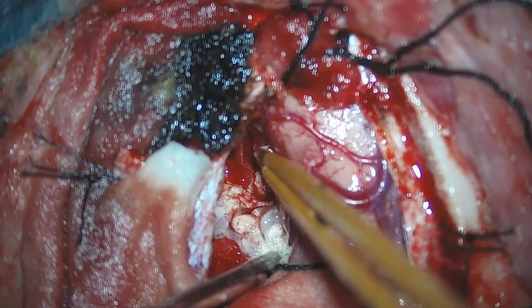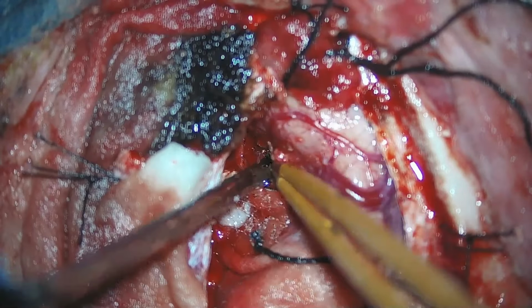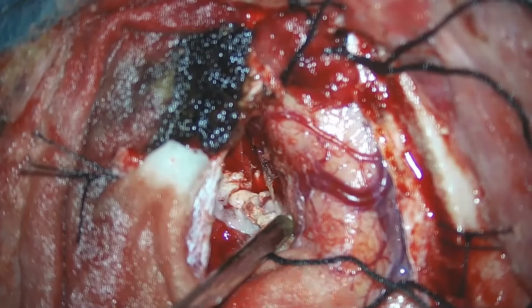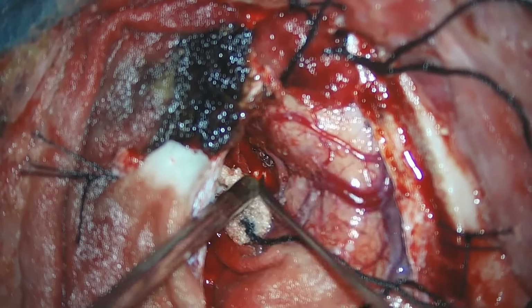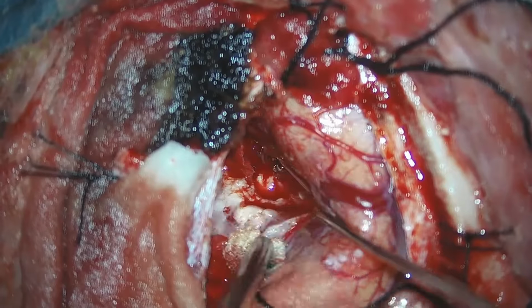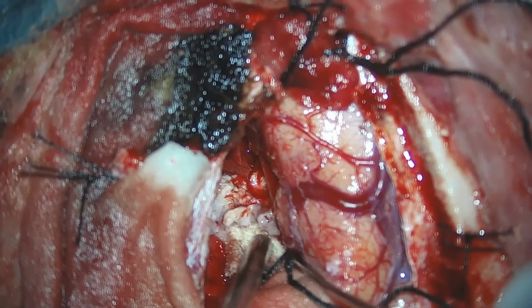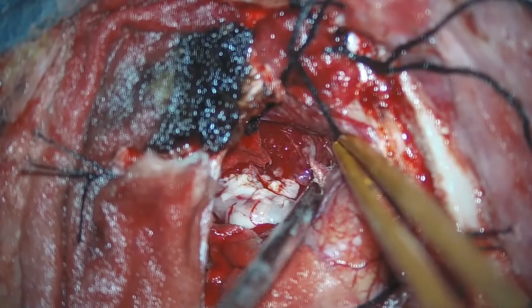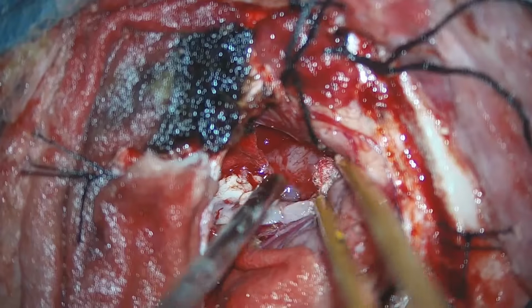With every step, we use cotton pledgets carefully placed in the plane achieved between the tumor and the normal brain. Once the plane is achieved, we can slowly dissect out the lateral margins and enter the tumor. Here, the tumor is very large, extending into the lateral aspect, so the plane creation was difficult.